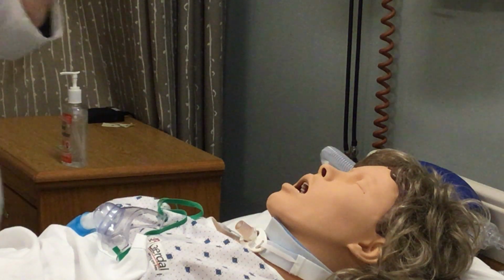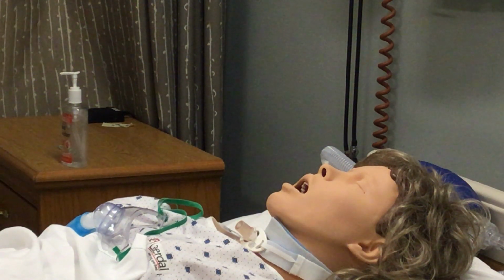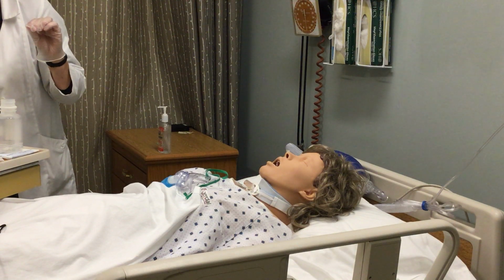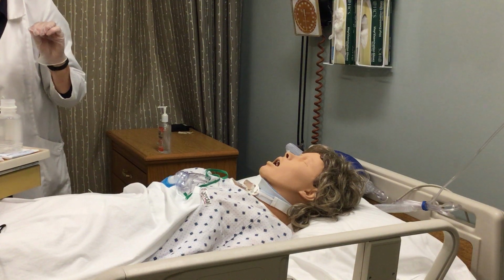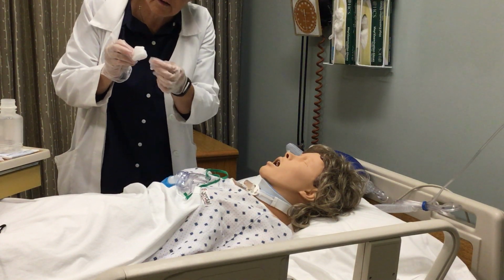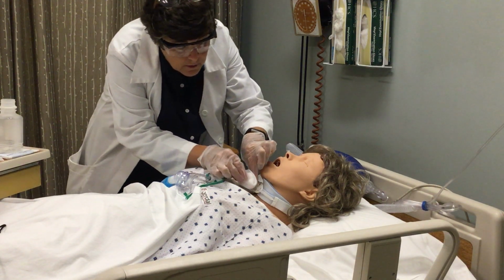Okay, so I've cleaned the stoma. Using a dry 4x4-inch gauze, pat the skin lightly as well as the exposed surfaces of the outer cannula. Okay, so I still have some 4x4s remaining in my kit, and this hand is sterile. I gather them by the corners so they look kind of like little wontons. You can usually get a 2-for-1 out of this. One side can dry the stoma skin, the other side grabs the top part of the flange.